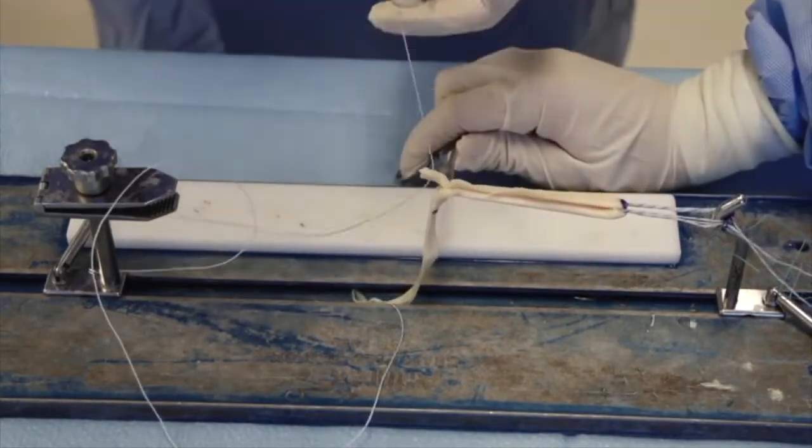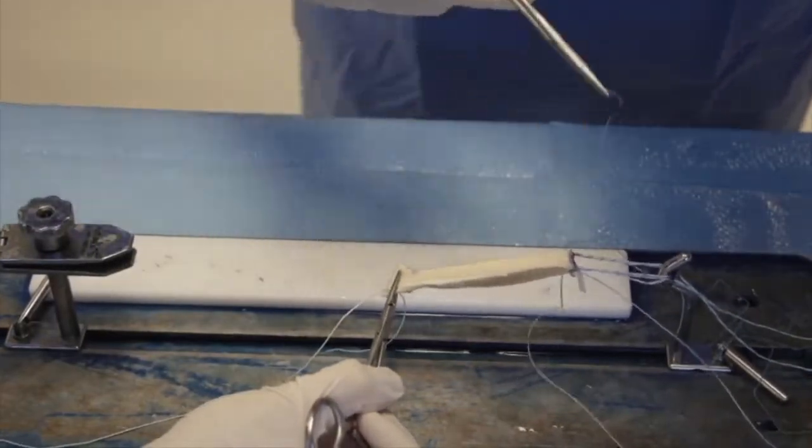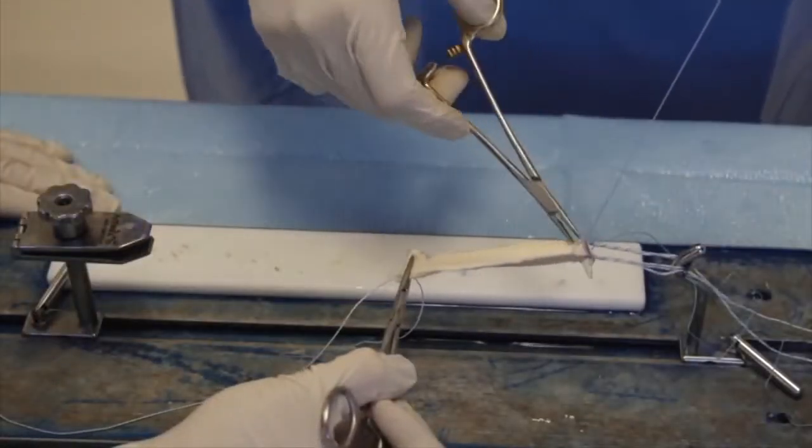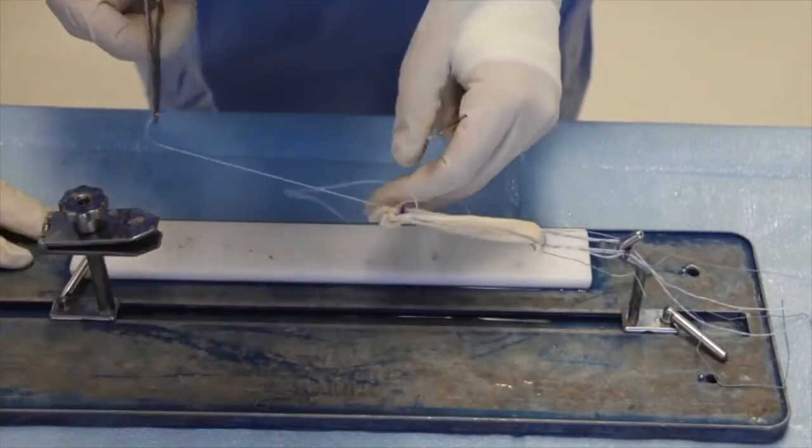A stitch at each end of the tendon is made with a non-absorbable suture leaving a tail. The needle is then passed through the other two strands of the graft. The same procedure is then repeated at the other end.